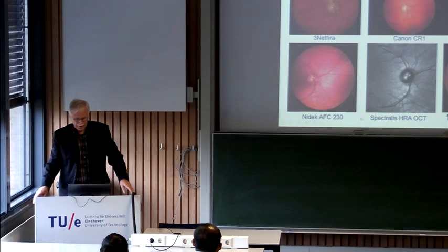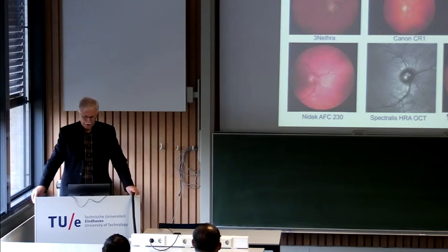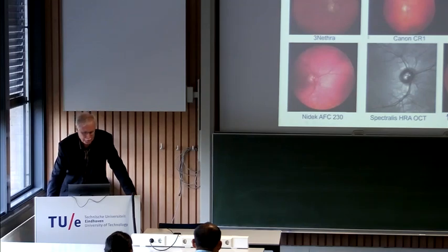We compare this with multiple cameras. In Maastricht University, we had a good collaboration with the eye hospital. We sent several of our students there, and they had 6 different cameras. 15 students took images from these 6 cameras, so we had a whole bunch of images. This is the same retina, and we took, of course, left eye and right eye, and 15 people. And then we compared all our software.